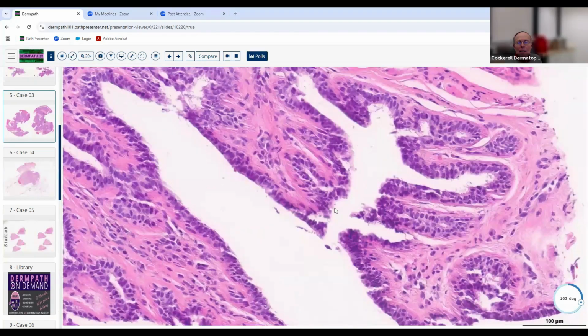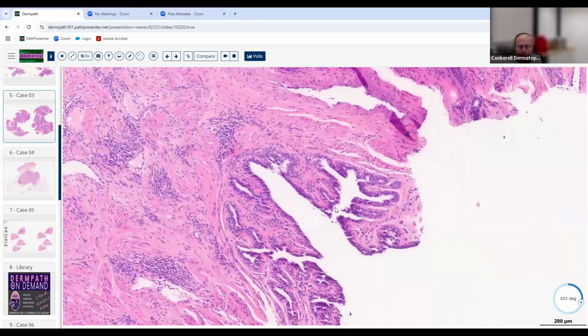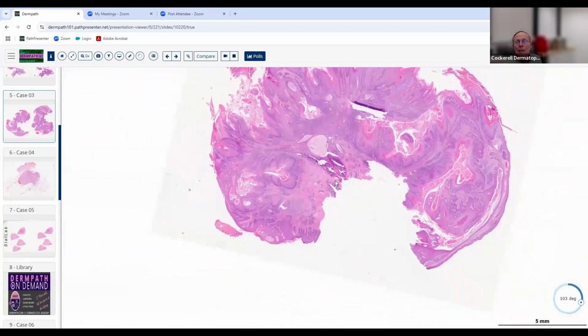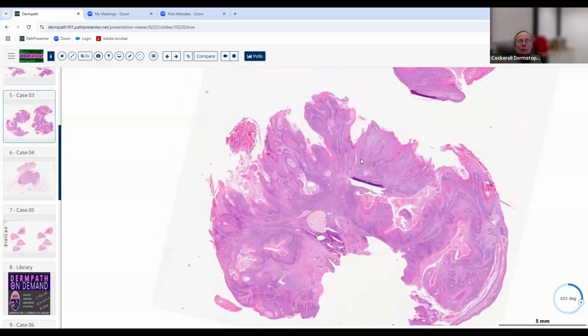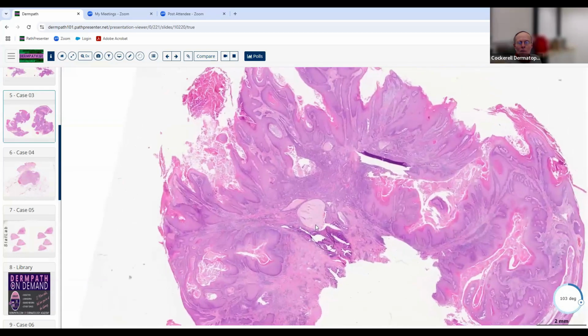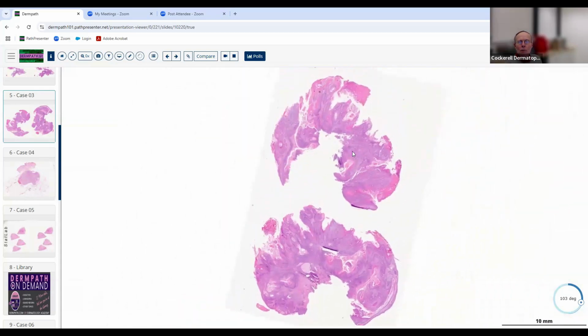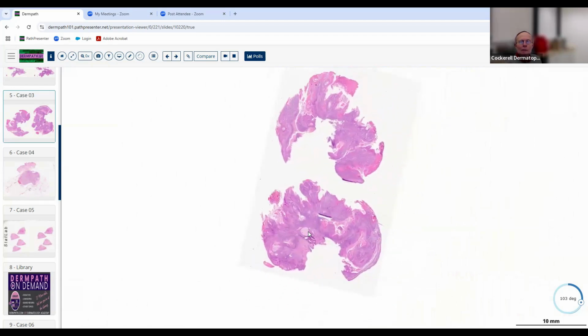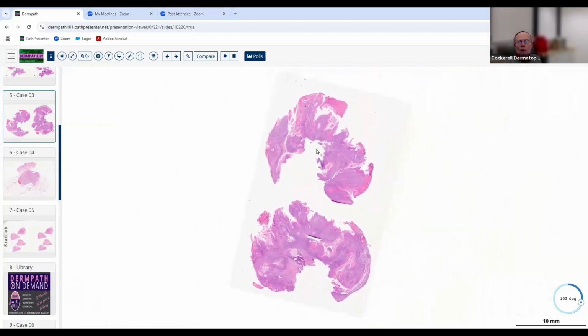Nipple adenoma. Now, you're not going to get this on the exam. I'm not going to show it to you, but we just wanted to show you this as an example. It's interesting because this one's got all this verrucous hyperplasia, which is a little bit unusual. You don't always get that. Sometimes you just see only this component to it. And this one had a couple of mitotic figures. So whenever you see anything on the breast, obviously you want to make sure that it's not something more nefarious.